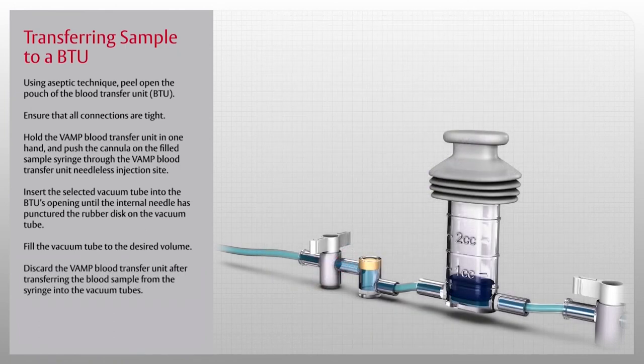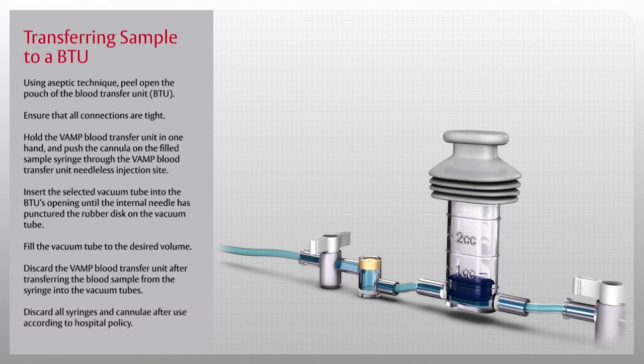Discard the Vamp blood transfer unit after transferring the blood sample from the syringe into the vacuum tubes. Discard all syringes and cannula after use according to hospital policy.